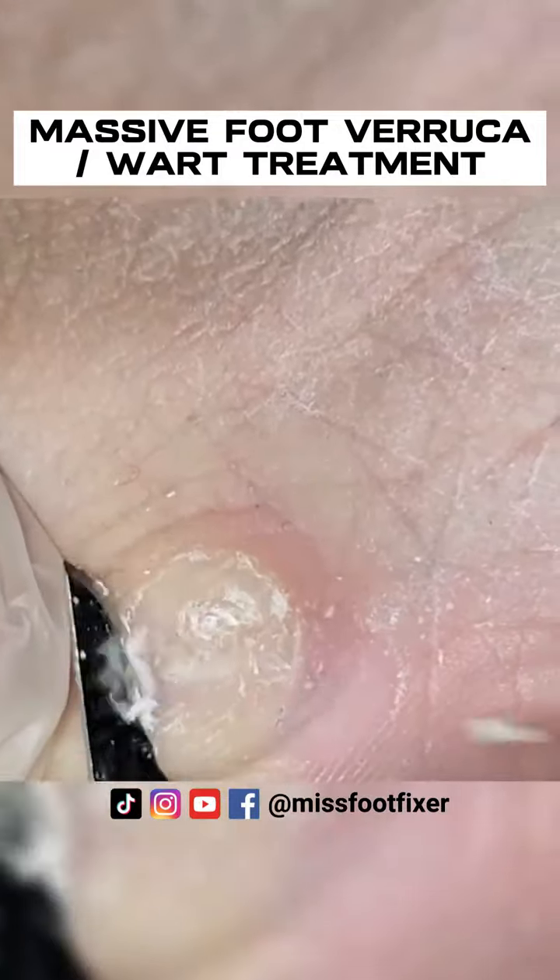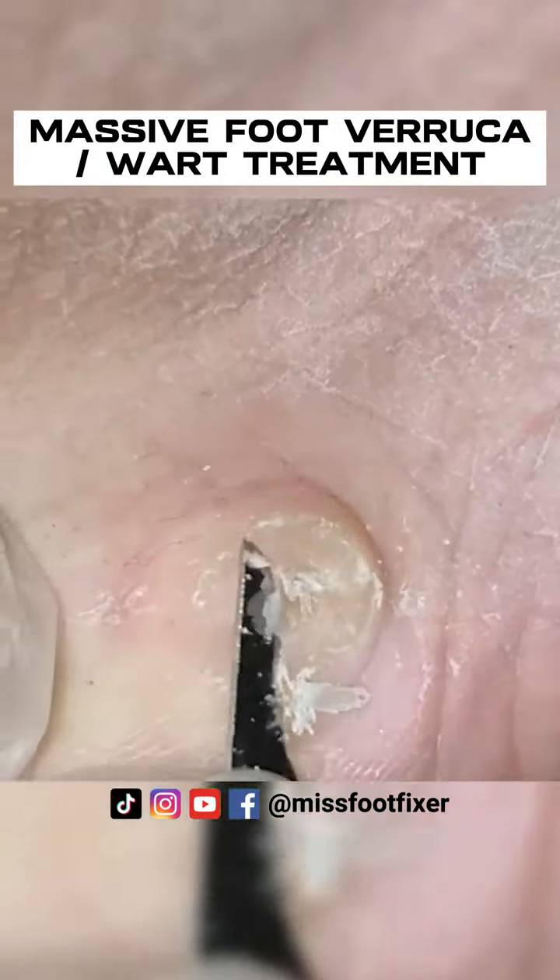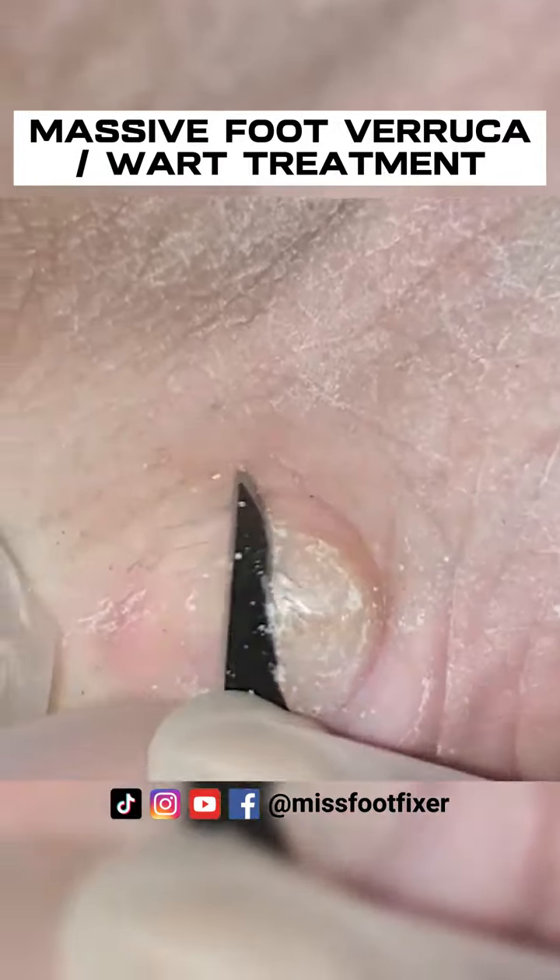All that the corn itself is causing this burrow. Burrow. Kind of circular. So that was the first layer.